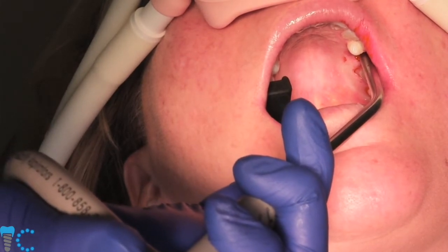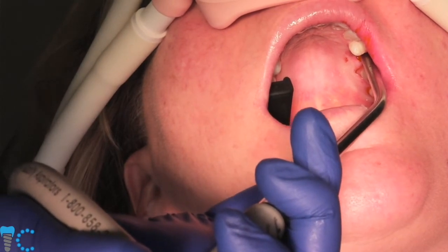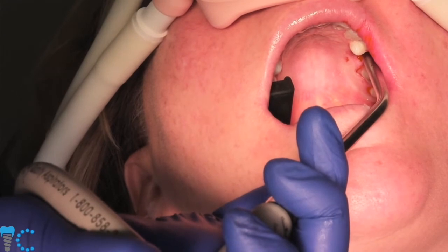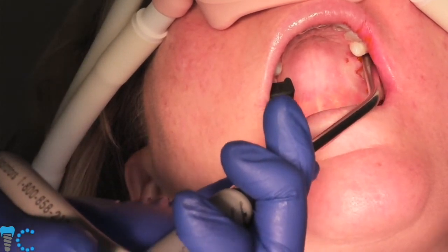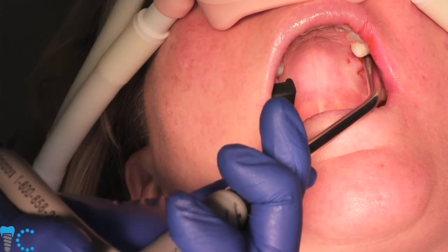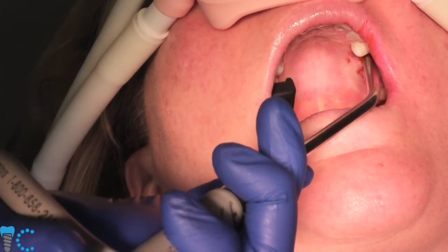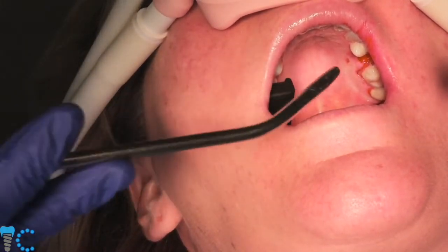Oh, so you're going 800 to 20 RPMs. Down to 20 RPMs, and the reason is to use the tap. The tap is what threads the hole, and we want to thread the hole very slowly. So we're going to use this instrument right here. This is our adapter. We're going to place the adapter in the handpiece. So there's our adapter in the handpiece. Oh, let me get that little... With the black O-ring on it.